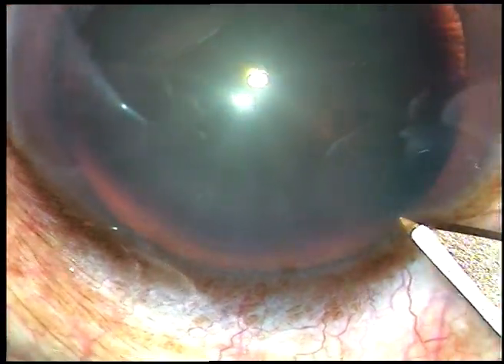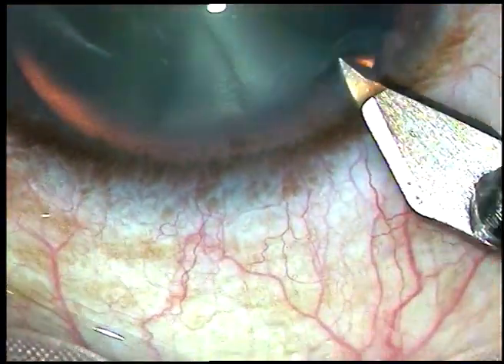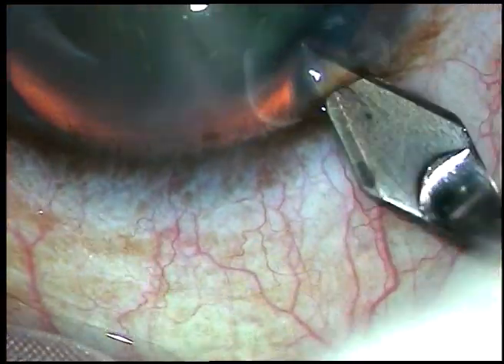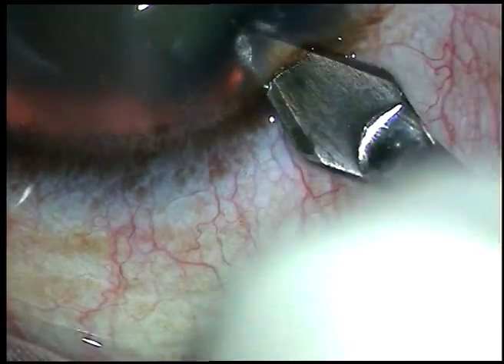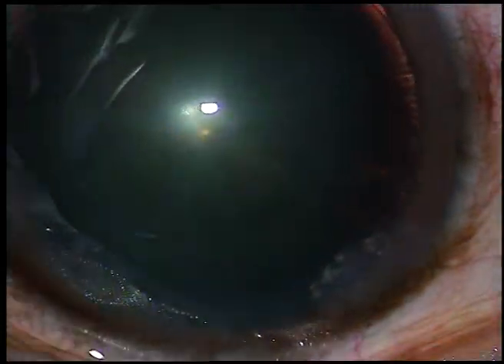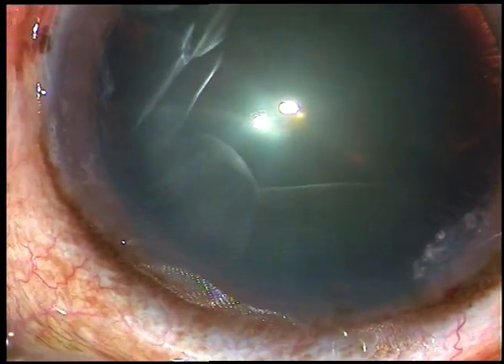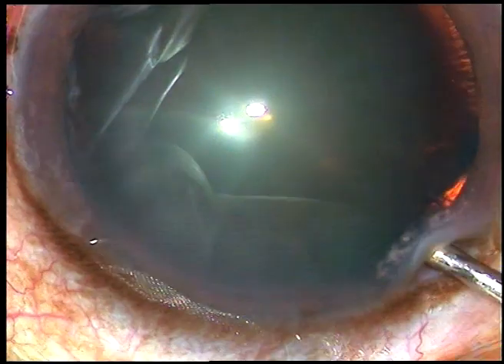Friends, a posterior capsular rent occurred in this cataract surgery. Let us see how it happened and how I managed this case.